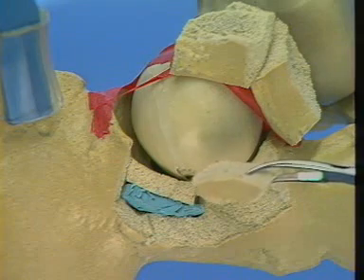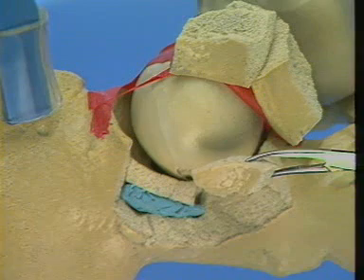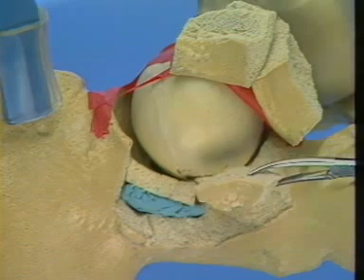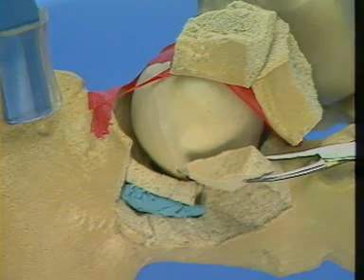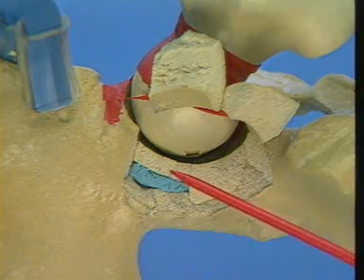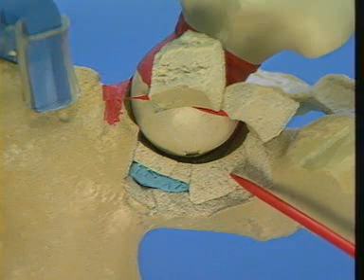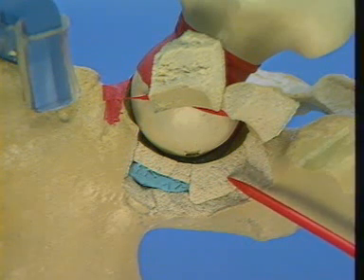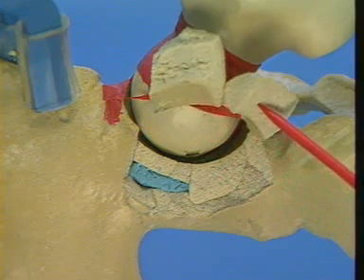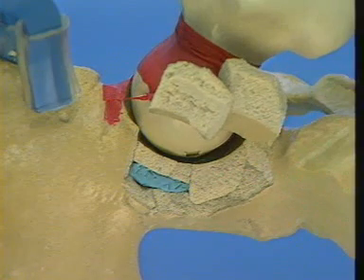The free fragment, including cartilage and cancellous bone, should be carefully examined for any keys to its proper position and orientation. Its correct position will also be determined to a degree by trial and error. These two fragments of bone that have been repositioned will not be directly internally fixed. They will, however, be held in place by the overlying segments of the posterior wall and the implant applied to the overlying segments.